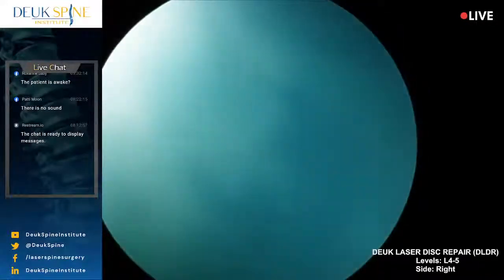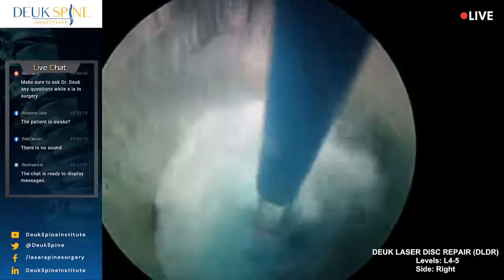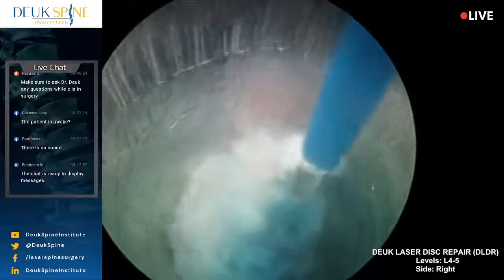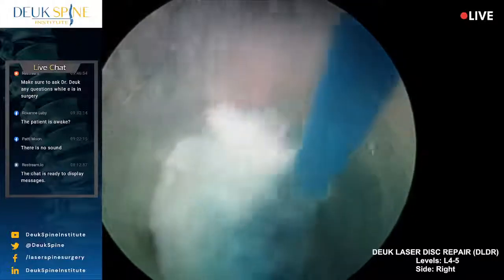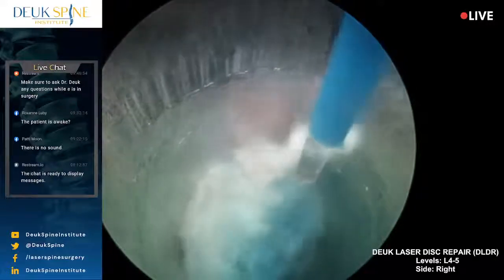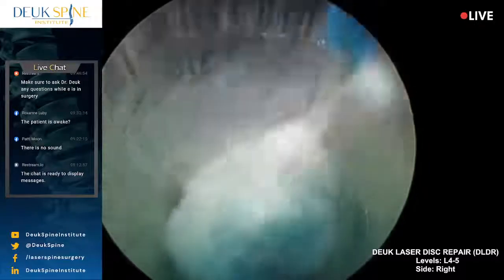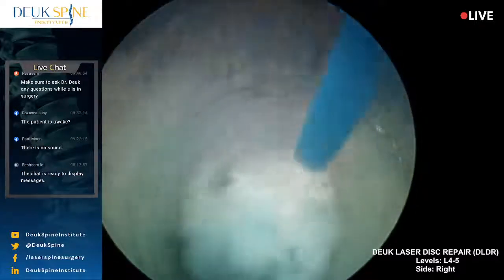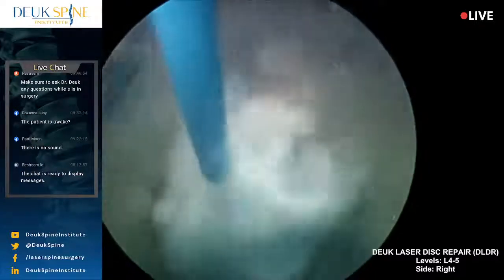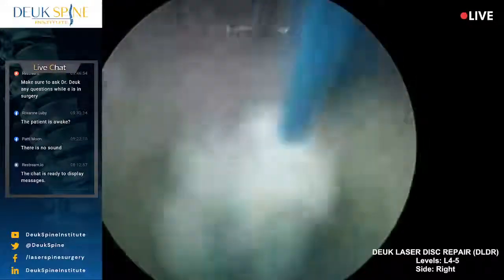Jordan, do me a favor. Turn on that light for them, and turn on this one over here. All right, we're going to bring the laser in. Get the laser on. Where's my pedal? There needs to be a pedal here. All right.